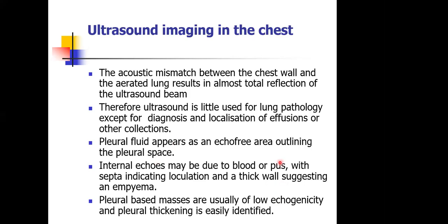And this becomes even clearer if we begin to see septations within that area of fluid collection, along with thickening of the pleural lining. Ultrasound scan also helps us to look at pleural-based masses, and we can easily characterize them as we do the scan.